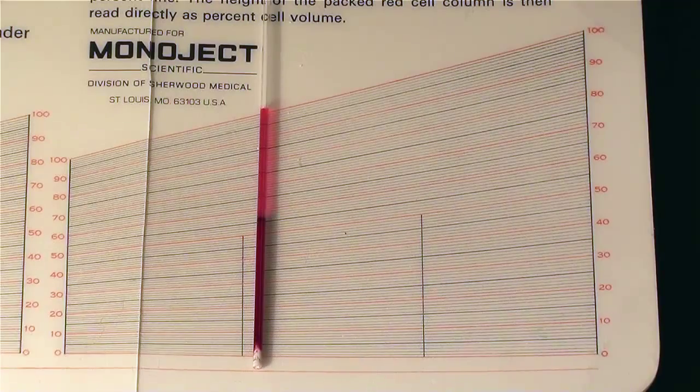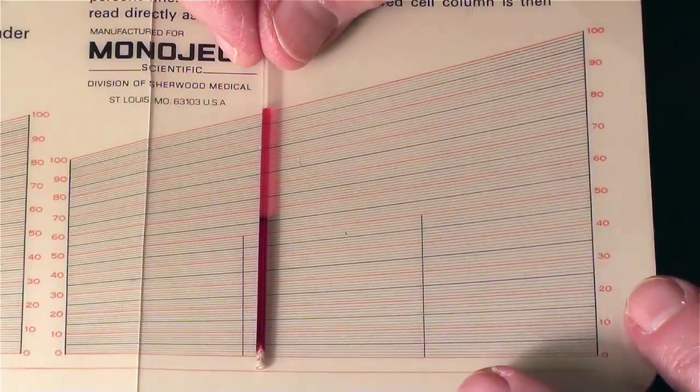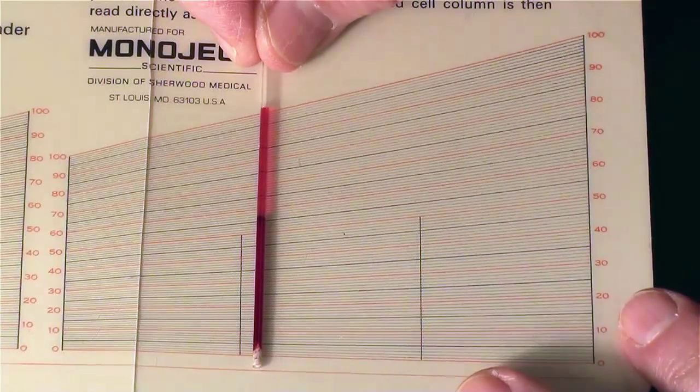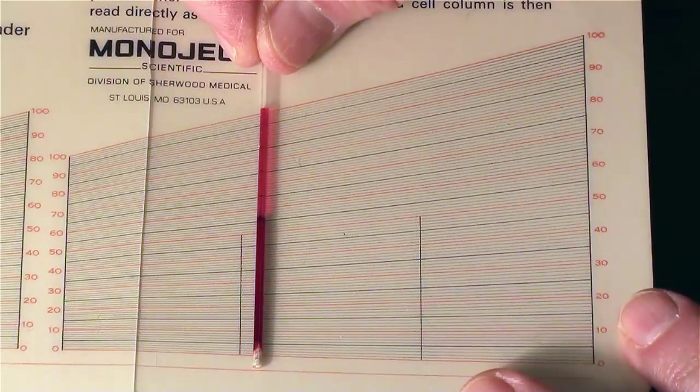Let's take a look at the hematocrit results. The hematocrit tube has been centrifuged. We're now analyzing it with this card.